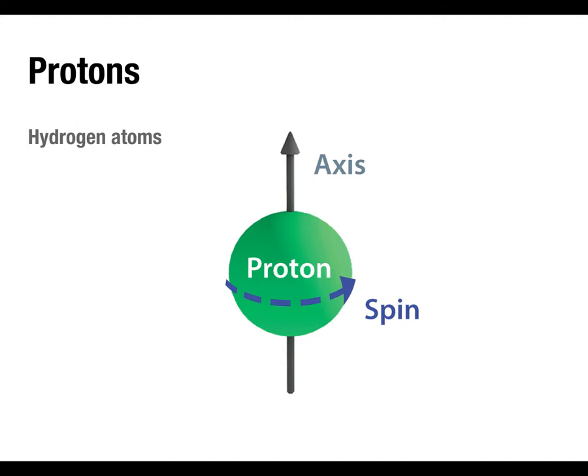Anyway. So protons are the fundamental building blocks of water molecules, and they're the thing that all human MRI really relies on. There are actually a number of different atomic nuclei that could be used for MRI, and that are used in chemistry. So in chemistry, they call it nuclear magnetic resonance, or NMR. MRI is basically an expansion of NMR to use it for human imaging. So in chemistry, you use NMR mostly on test tubes or very small samples.